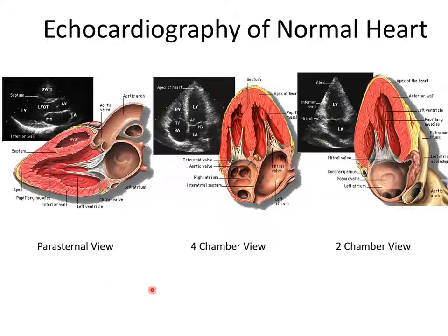You should know these basic orientations of the heart as seen on echocardiography. One of the reasons why it's very useful to know these orientations is that when data is provided to physicians such that they look at the heart and make a clinical call, it's usually provided in these orientations. For echo, it's always provided that way.